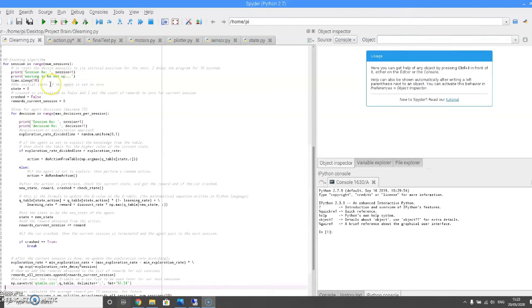Each session first starts with 10 seconds of waiting time. This allows the user to place the device in the testing environment. The state is initialized to 0, the value of crash is initialized to false, and we create a current value for the rewards for the current session. Then, for each session, a maximum of 15 decisions will be made.